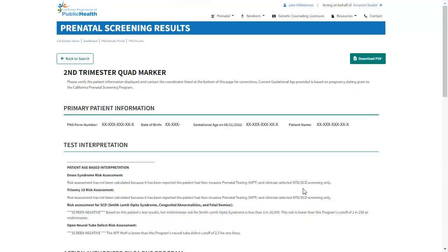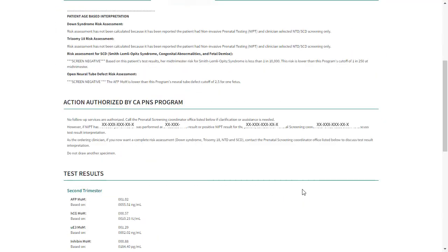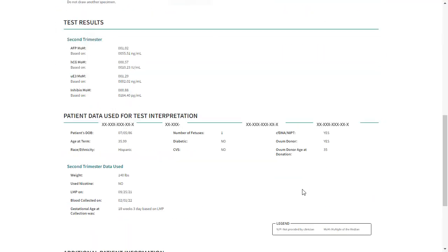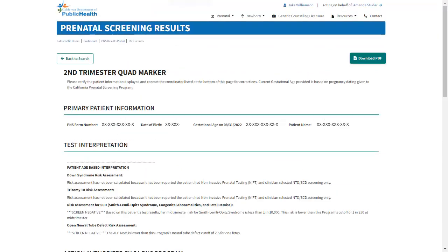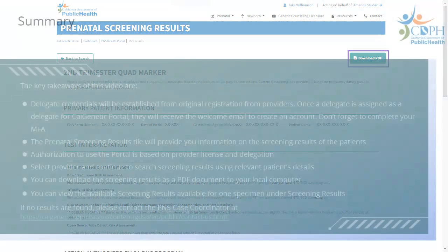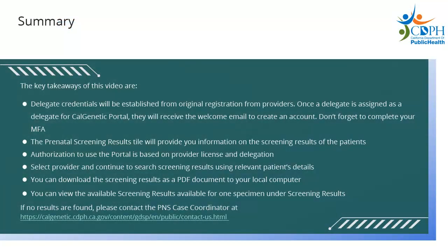You will be navigated to the results screen with the patient case information details. If you would like to download or print the result information, click Download PDF as highlighted on the results screen to download the result information in a PDF document to your local computer. Let's summarize.